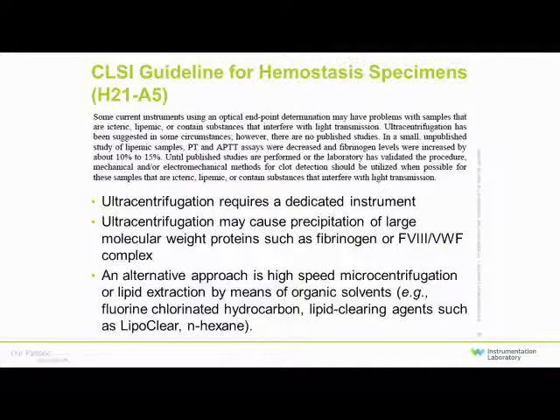The other thing that comes up and I get asked frequently about is lipemic samples and ultracentrifugation. I think many people confuse ultracentrifugation with microcentrifugation. Most of us in our labs don't have an ultracentrifuge. That's a dedicated piece of equipment. And actually ultracentrifugation can cause precipitation of large molecular weight proteins like fibrinogen, factor VIII, and von Willebrand factor.